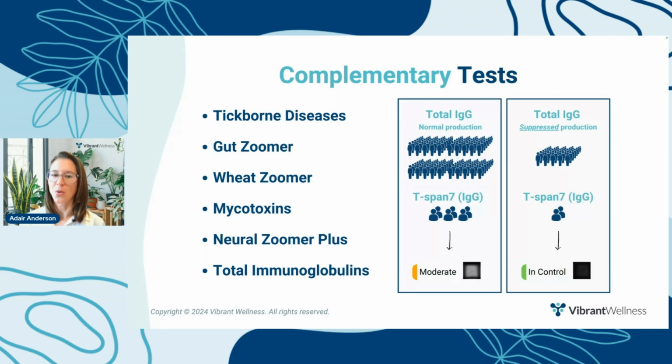And finally, the total immunoglobulins test. Serology testing is based on normal functional immunoglobulin production. The total immunoglobulins test assesses the number of immunoglobulins, which is helpful in those with suspected immune function compromise or those undergoing IV IgG therapy.